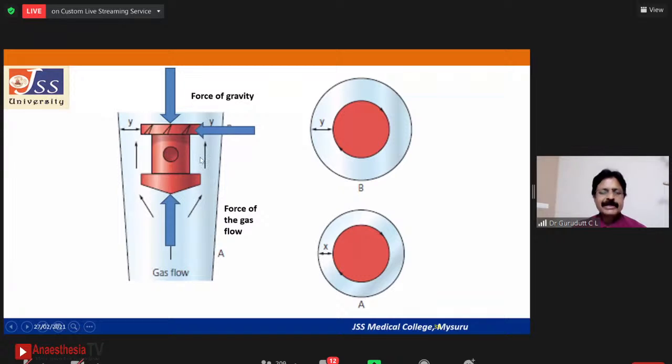Another thing is, many times when you're using flow meters in darker areas, especially in radiology suites, you can see a fluorescent dot here. This dot will also be asked in the exam: why is there a fluorescent dot here? It is so that you can know that the bobbin is rotating, even in darker areas. Another safety feature in the flow meter assembly is the backing of the flow meter assembly. There is also a fluorescent backing, so that you can see the bobbins rotating.